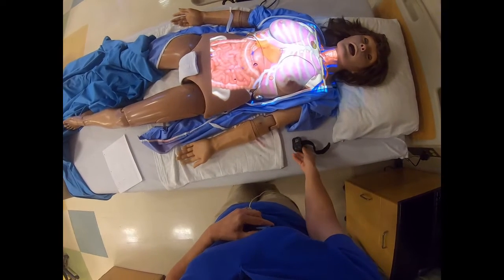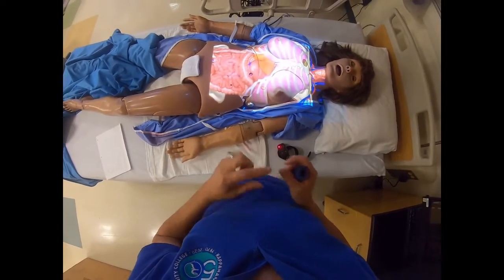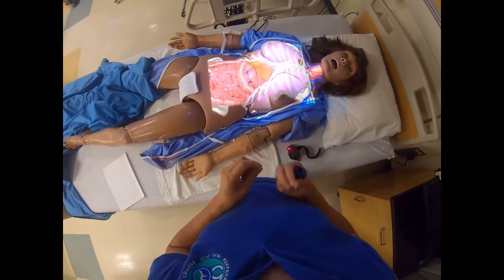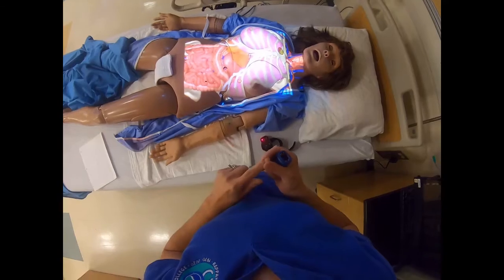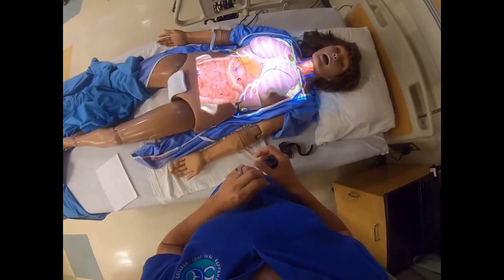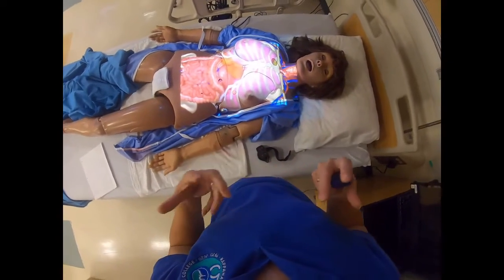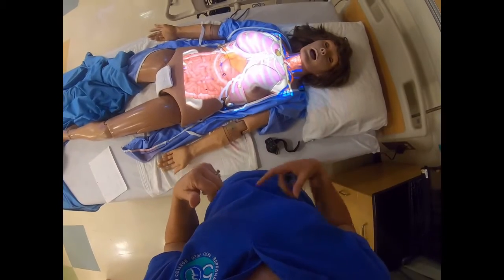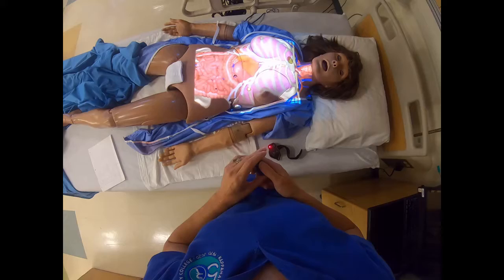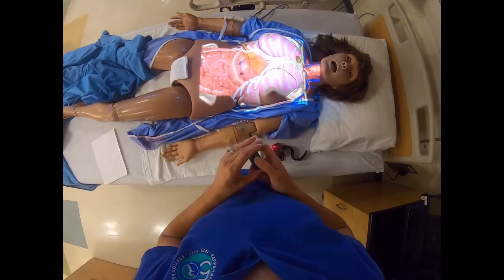The sensor that you are making emits infrared light that will pass through the skin and nails and bounce off of the red blood cells. The red blood cells have hemoglobin in them, and the hemoglobin within the blood is what binds to the oxygen and then is transported throughout the body. What we are measuring is the amount of hemoglobin that is saturated with oxygen.